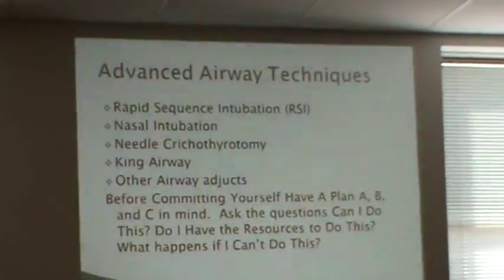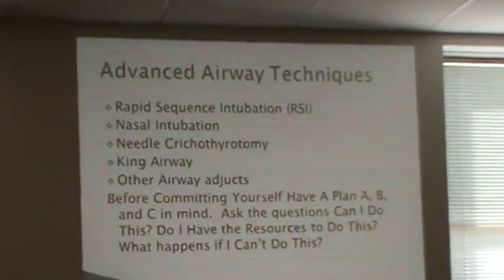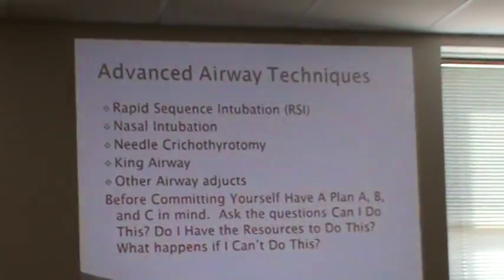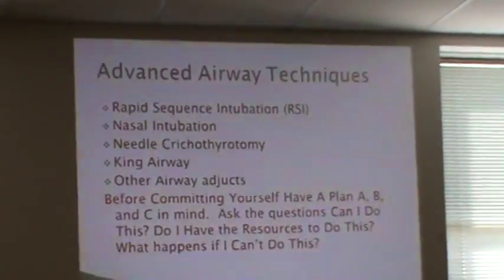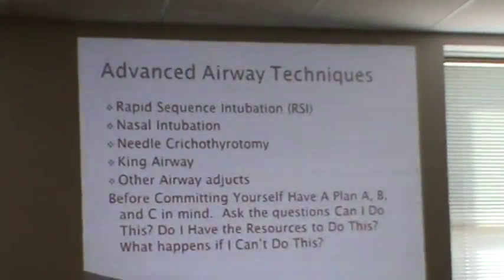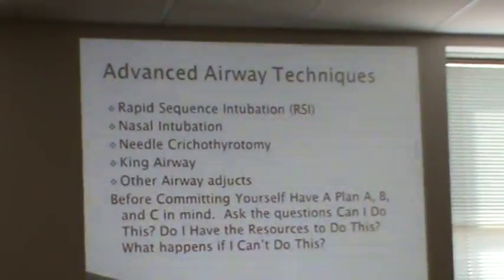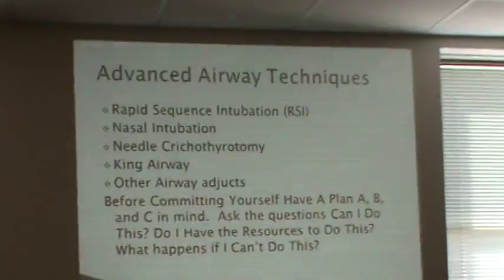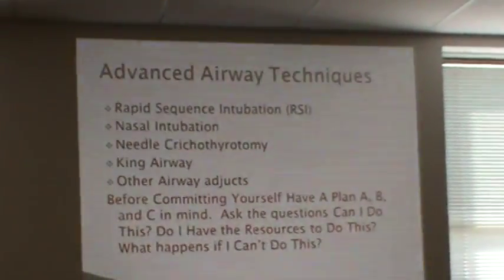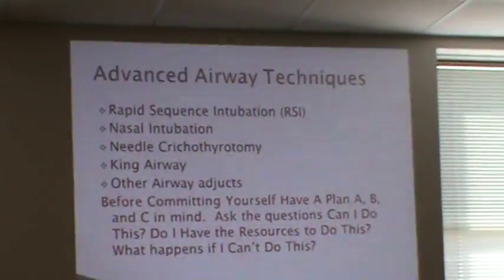When we get into advanced airway techniques, we're talking about rapid sequence intubation, nasal intubations, needle crikes, use of the King airway, and other airway adjuncts. Like we said before, committing yourself to any advanced airway technique, have a plan A, a plan B, and a plan C. Ask the questions, can I do this? What is your experience level? If you don't think you're able to do it, and there's nothing wrong with that, then don't. Use your basic techniques until you can get to more optimal resources.